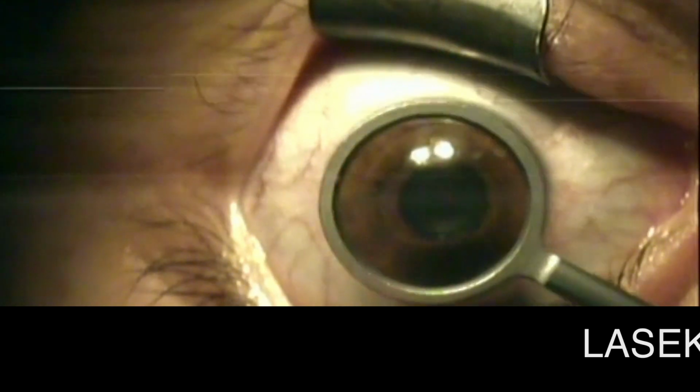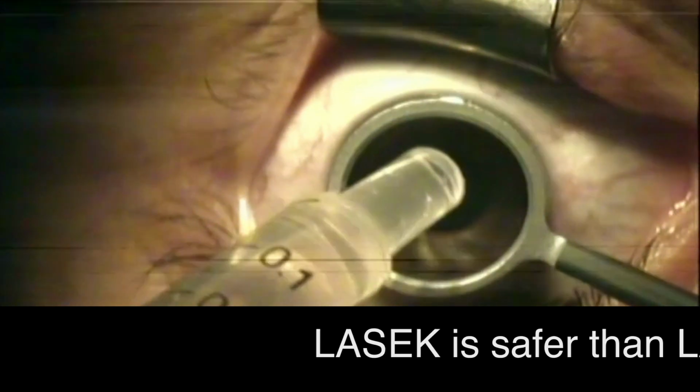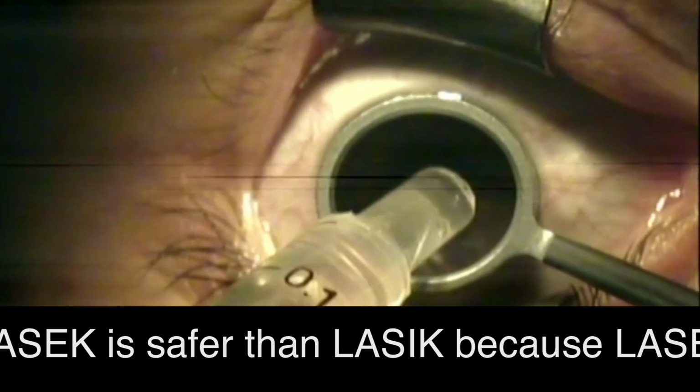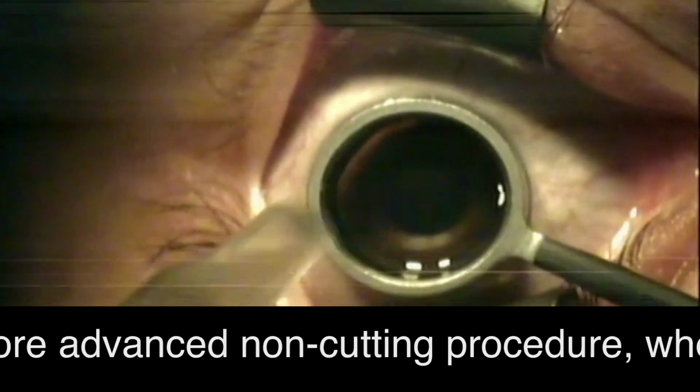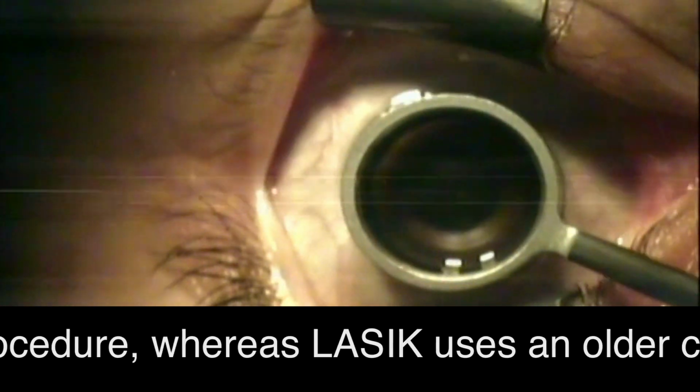Okay, so this is a LASEK. It's also called the alcohol-assisted PRK. It's a more advanced way to do a PRK, so it doesn't hurt. It was invented at Harvard by myself and two other physicians, John Talamo and Juan Carlos Abad.